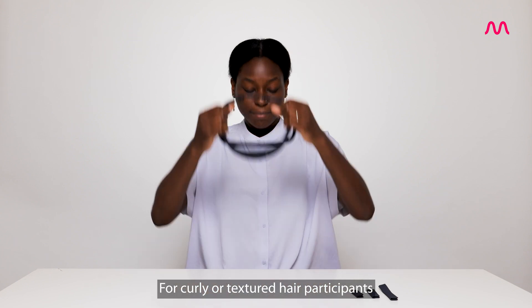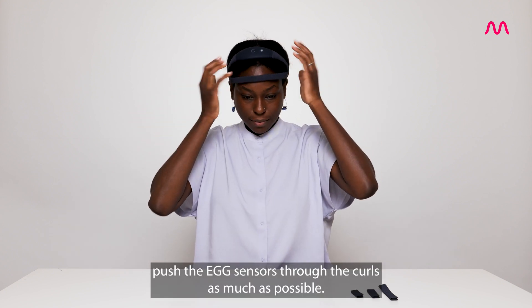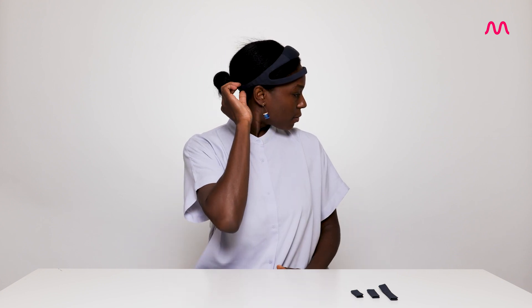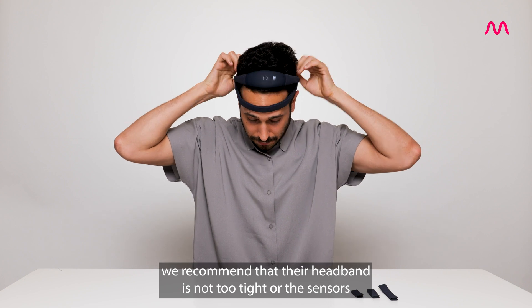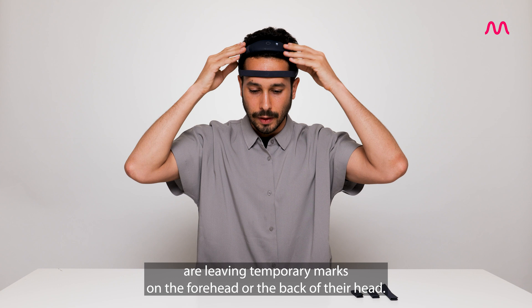For curly or textured hair participants, push the EEG sensors through the curls as much as possible. Make sure the sensors are in contact with the scalp as much as possible. For participants who have short hair or are bald, we recommend that the headband is not too tight where the sensors are leaving temporary marks on their forehead or the back of their head.